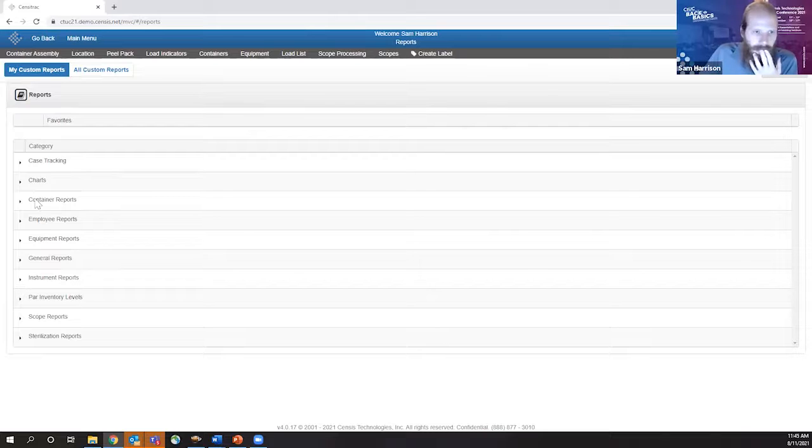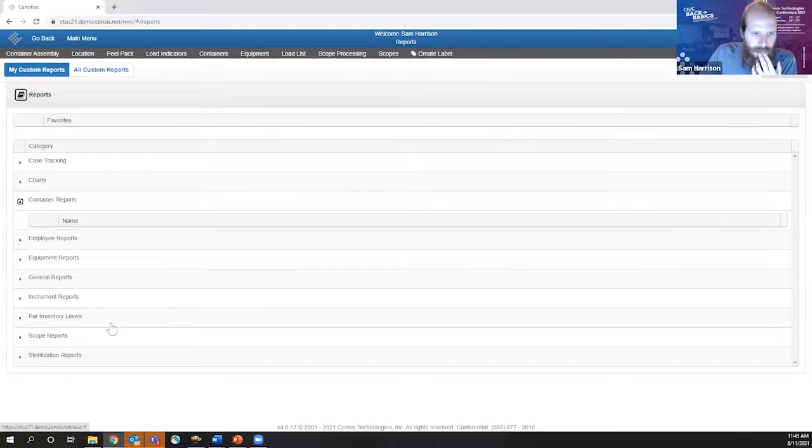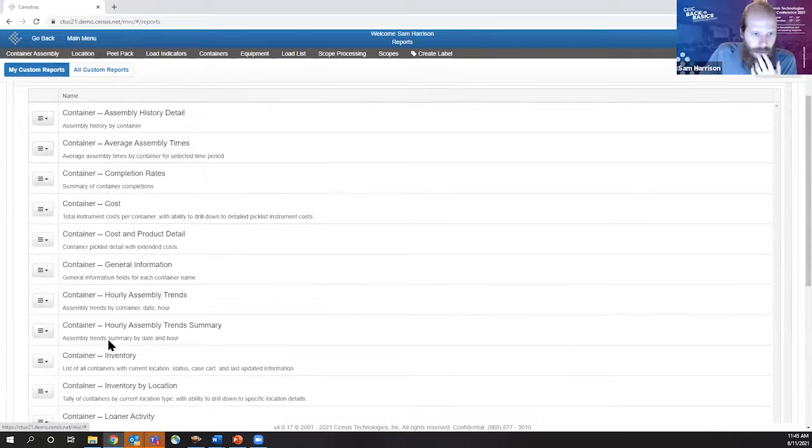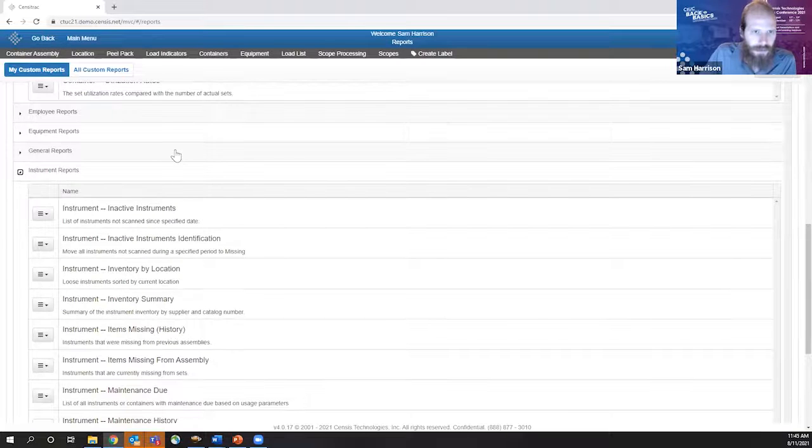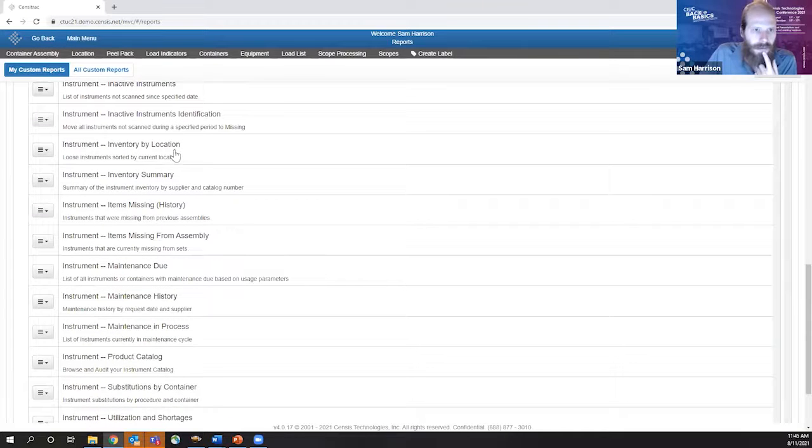Right, right. In inventory report, I'm wondering if that means instrument inventory. Instrument, and then the inventory report. Where's that inventory report? Oh, here it is, inventory. Yeah, I would need some clarification on that question. So Stuart, I know we got to run now, but if you want to type that down, we're going to take these questions and work on them. So sorry. Go ahead, Grace.